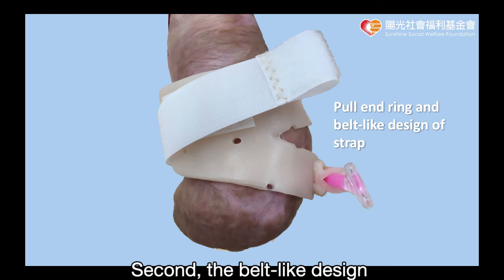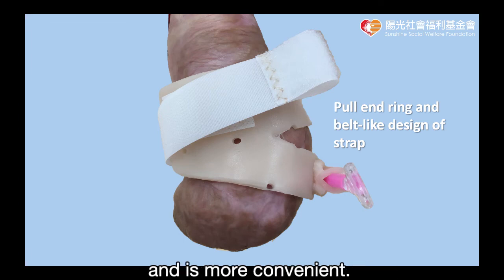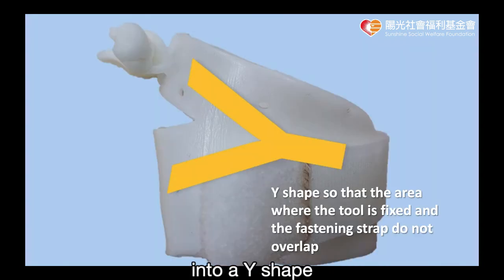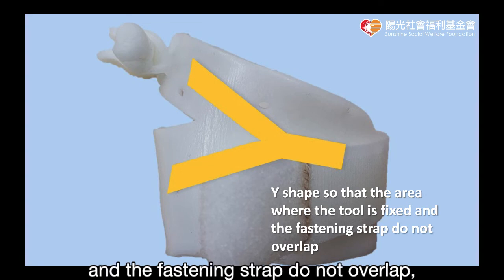Second, the belt-like design will prevent the splint from rotating and is more convenient. Third, by cutting the splint from the center into a Y shape, the area where the tool is fixed and the fastening strap do not overlap.